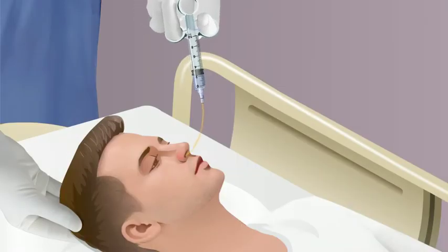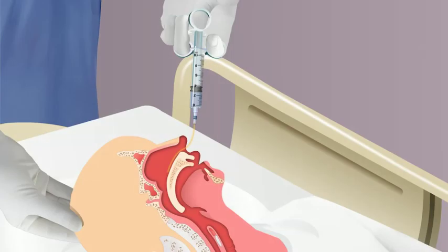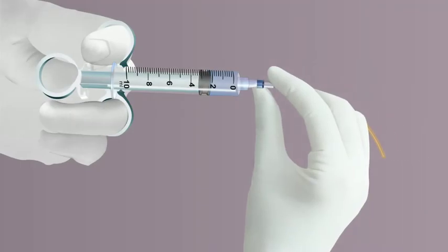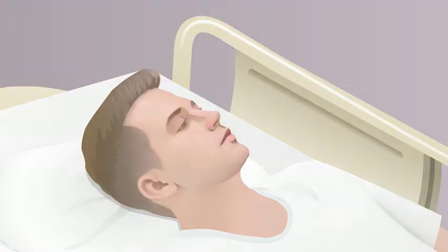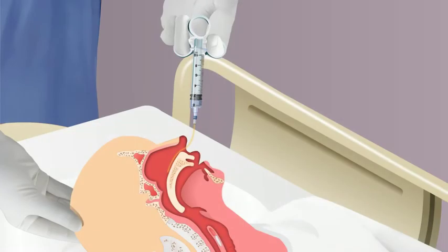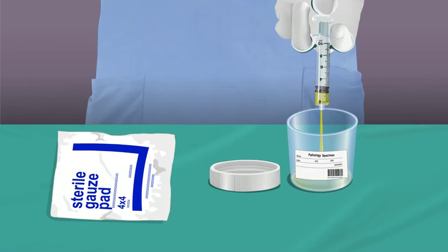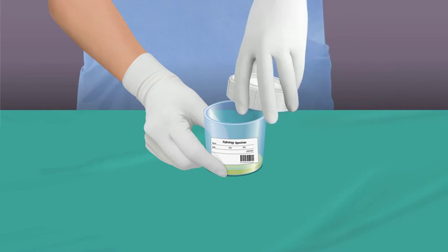Instill 1 to 1.5 milliliters of non-bacteriostatic saline into each nare. Insert the tubing into the nare and suction secretions. Repeat the procedure for the other nare per the practitioner's order. Insert the specimen into a sterile container and place the top securely on the sterile container.